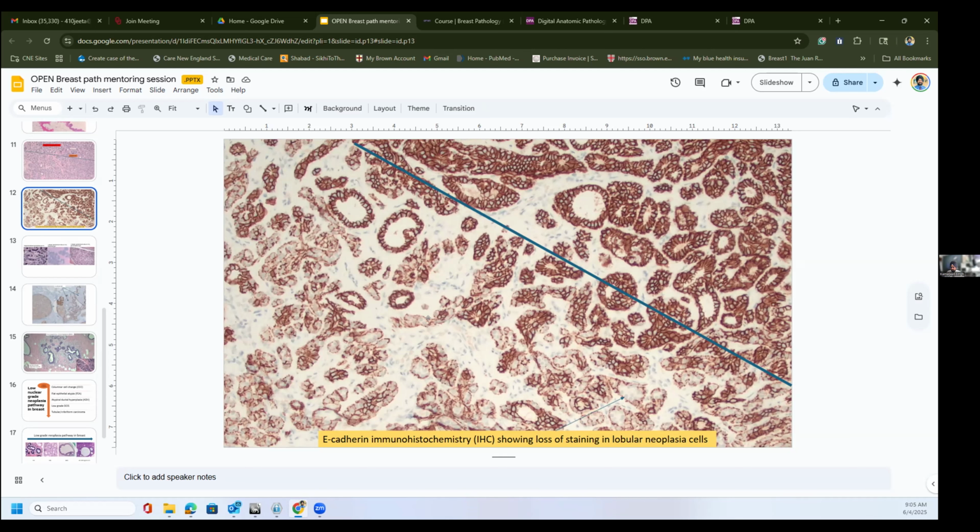And you will notice when you go to that module part, and especially in the first part, we have the tissue fixation times. Whenever you're dealing with breast tissue, the moment the breast tissue is removed, you have to put it in formalin within 1 hour. If you don't, it violates your pre-analytical condition to test estrogen receptor.